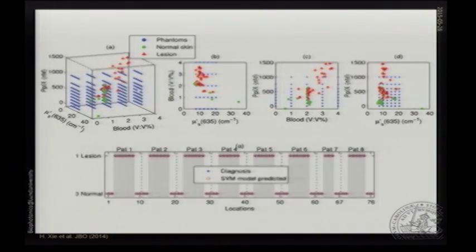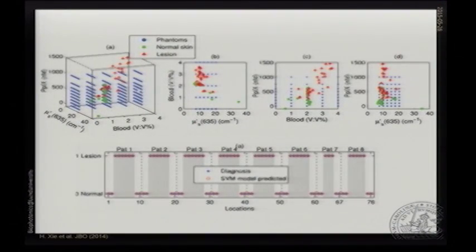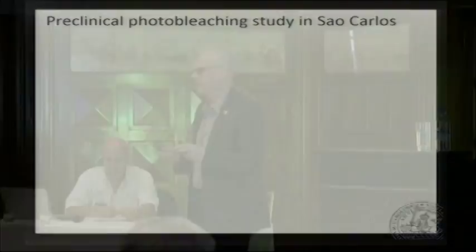And then we actually tried to use multivariate analysis to see, can we use this data to tell whether all these positions that we measure are lesions or non-lesions? And with this information, actually we didn't miss a single point. All the points were correctly characterized with this. So this seems to work quite nicely, that we have this rather simple system with LEDs and APD detectors, and that we modulate them so we get rid of any ambient light. And then we can assess this quite nicely.